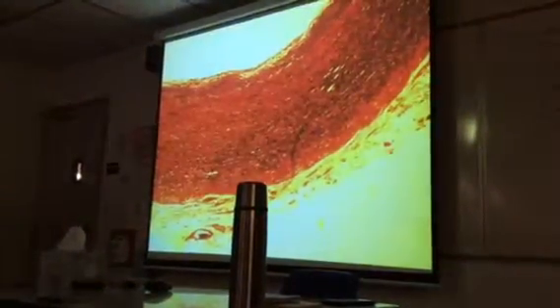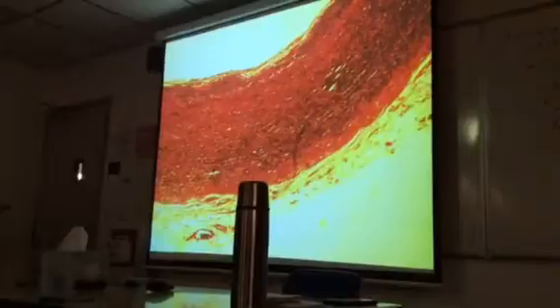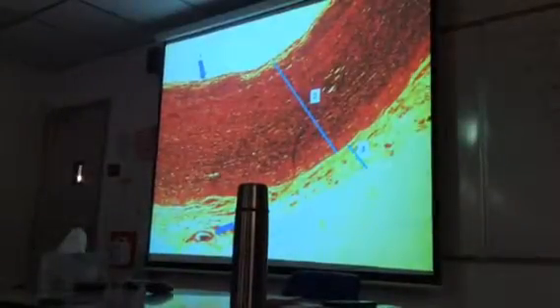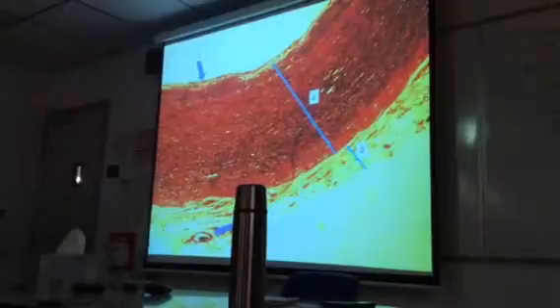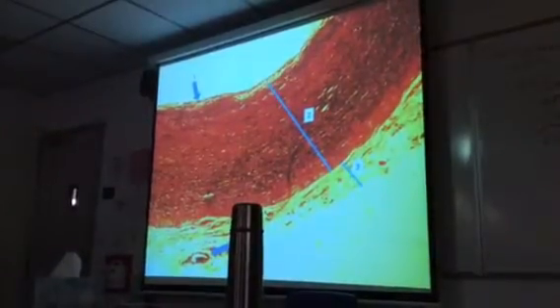And then we did blood vessels. I might ask you, identify the type of blood vessel. That's an elastic artery. I might ask you to identify tunics. I'm pointing to them there, 1, 2, and 3. 1 is pointing to TI, tunica intima. 2 is tunica media, 3 is tunica adventitia. 4 is pointing to the vasa vasorum. That's not a tunic, it's a structure.